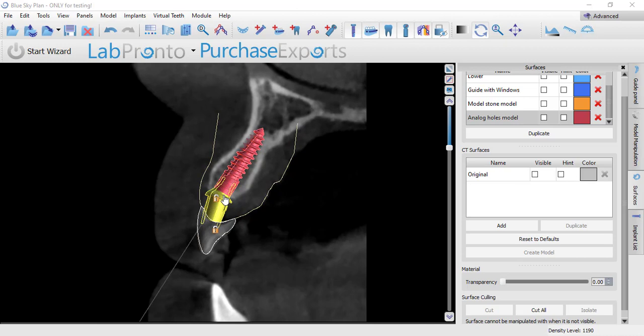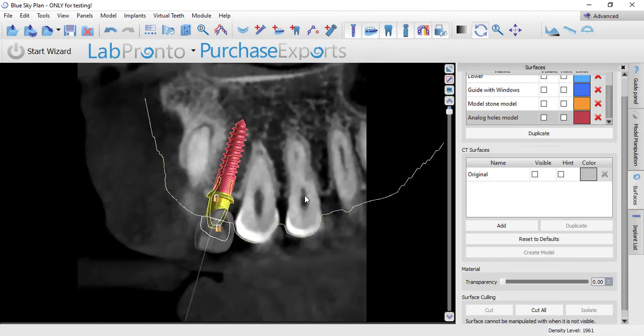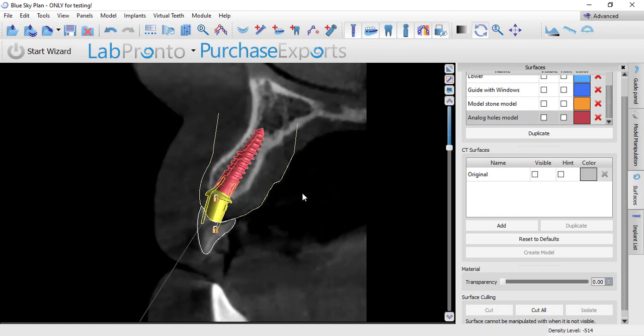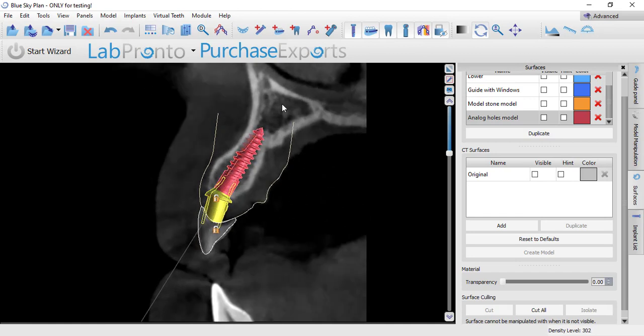This becomes very important when you're dealing with angled multi-unit abutments. This is a good example for a video because, as you can see, there's only one spot this implant can go — narrow ridge, I can't really alter my implant position. If we just went with a straight abutment, the screw axis hole would be going right through the middle of the facial of that tooth, and aesthetically that's not going to fly.